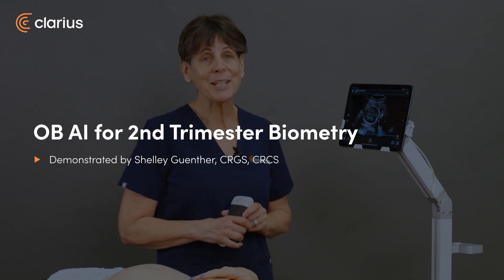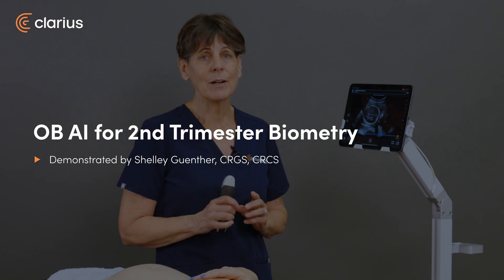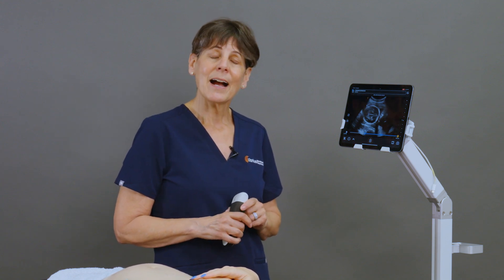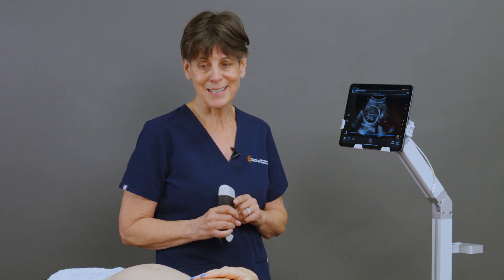Hi, I'm Shelley, and today I'm going to introduce you to Clarius OB AI. We are on a mission to make fetal biometry measurements easily achievable for all caregivers, regardless of their level of ultrasound experience. Today I have a second trimester pregnancy, and I'm going to show you how the AI makes fetal biometry measurements really easy.